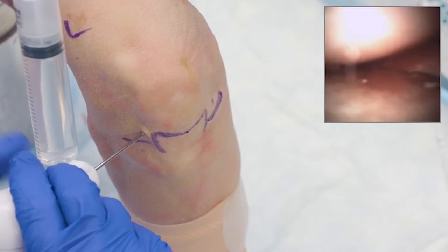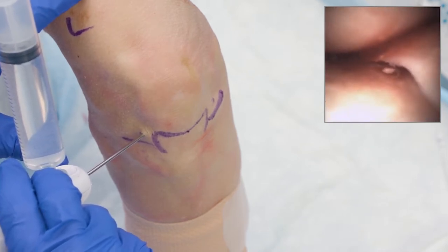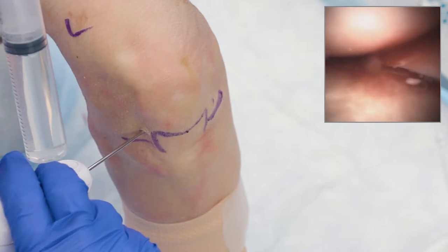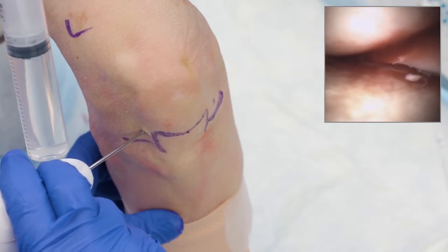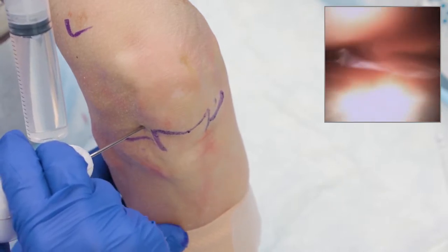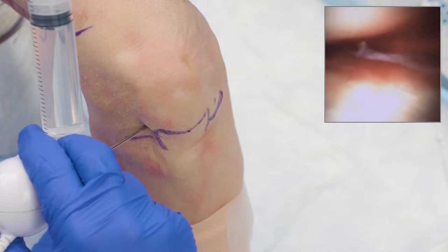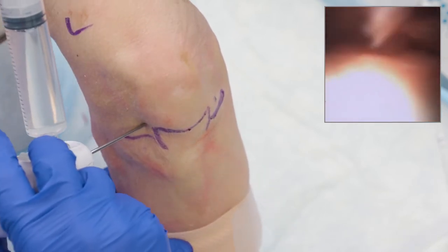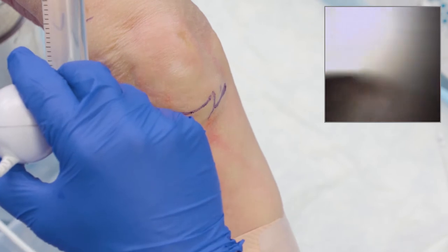Once inside the knee joint from the medial side, I can start my diagnostic evaluation of the medial meniscus. We're seeing the mid-body of the horn, with the femoral condyle on top and the tibial plateau below. I'll give a little flush to clear up the view, get rid of synovial tissue, and then evaluate my cartilage on both sides. To get to the posterior horn, drive right to the little black triangle or space that's there, then sweep around to see the horn. Movement of the knee — gentle flexion to extension — will create more visualization, allowing me to get underneath the femoral condyle.